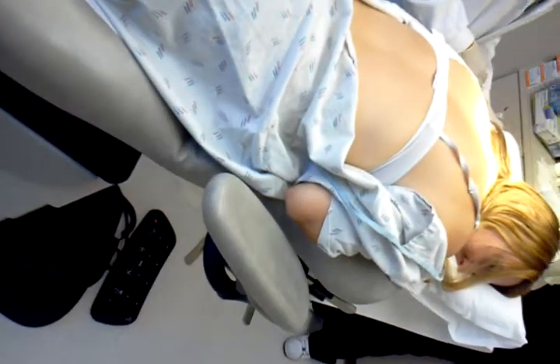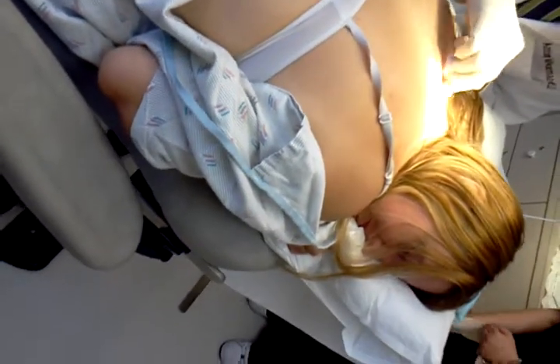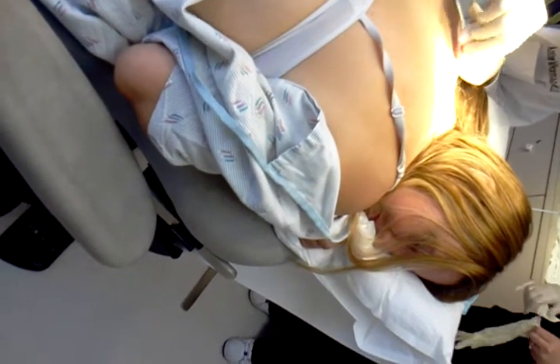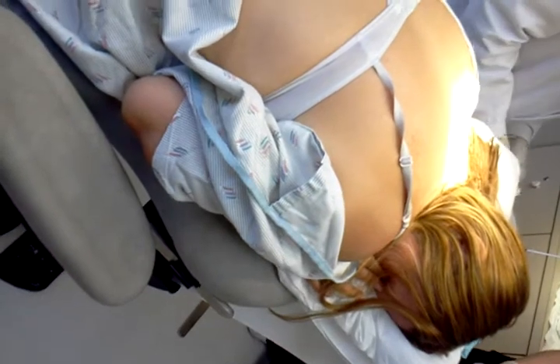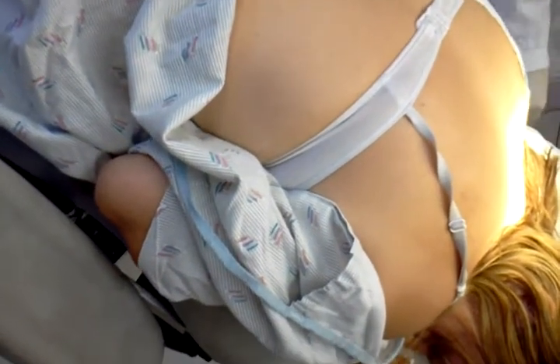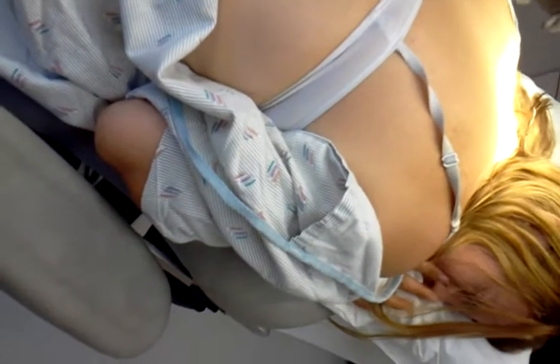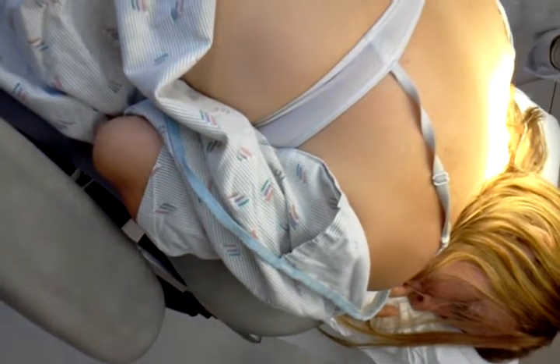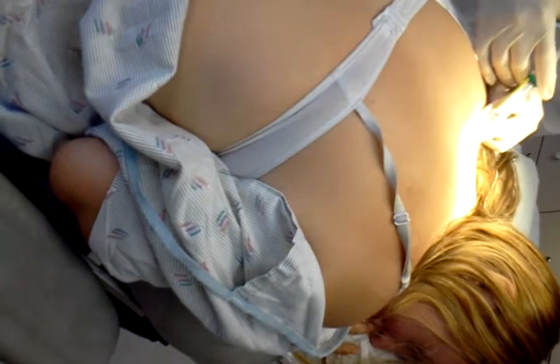We're going to feel just a little bit of cold, wet soap, and that's just to cleanse the area, okay? And then you'll feel a couple little pinches, and that's the numbing agent. And we'll get the area numb, and then we'll get this off there. You may just want to give me a 3 cc, Laura. Any minimal bleeding will get stopped, and we'll get a patch on there. We'll send the specimen off to the pathologist, and when we get the result back, we'll give you a buzz, okay? On 3, you're going to feel your first little pinch, okay? 1, 2, and 3.